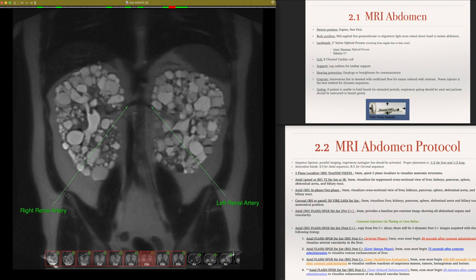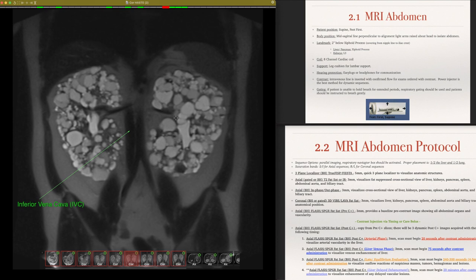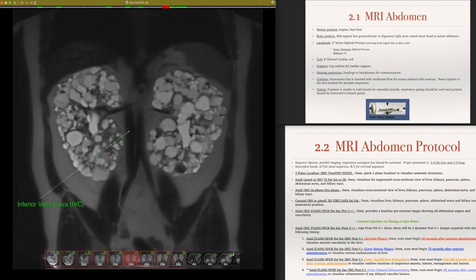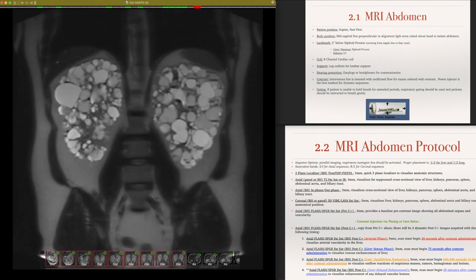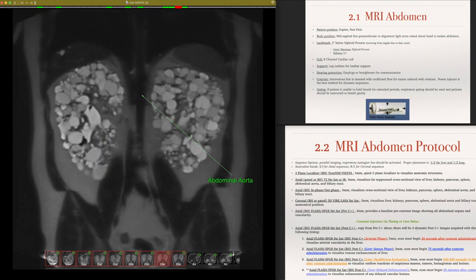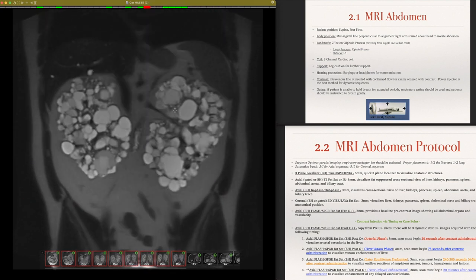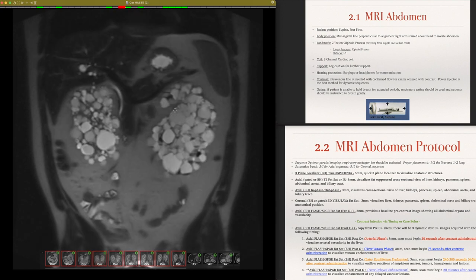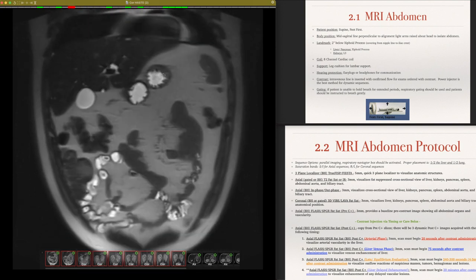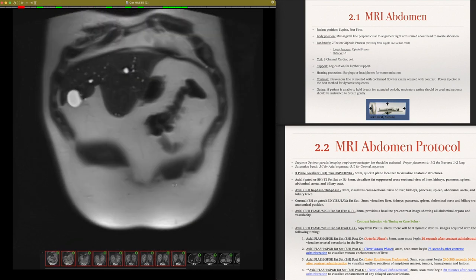thus the right renal artery, okay, and the left renal artery going into these cysts. You can even see that some of these cysts are impinging on these renal arteries, likely causing high blood pressure. So some definite concerns here in terms of pathology. So again, just a coronal view, walking you through liver, okay, pancreas, stomach, okay. You have your intestines down here, okay.